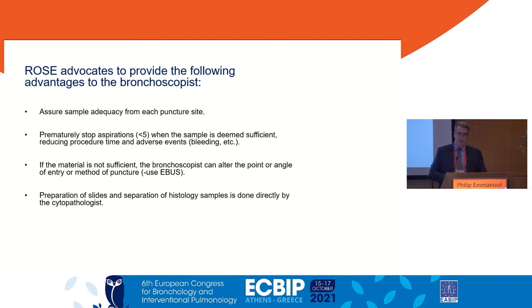We can also use ROSE with a certain modality. If we do TBNA and we don't have sample material, we can switch to EBUS TBNA. At the moment, with systematic lymph node assessment, this is also not very contemporary.